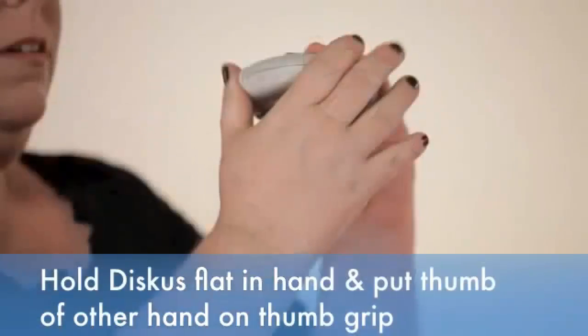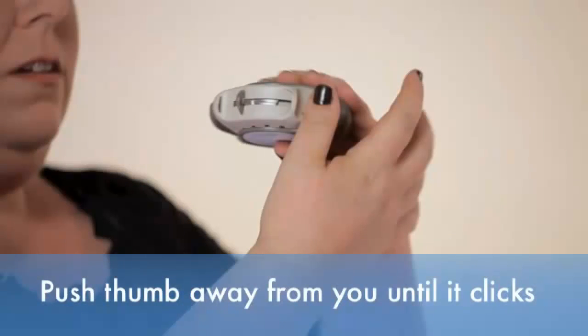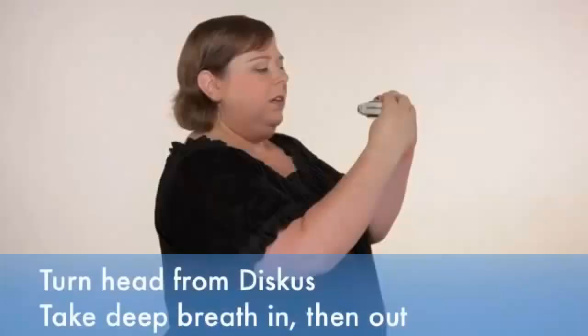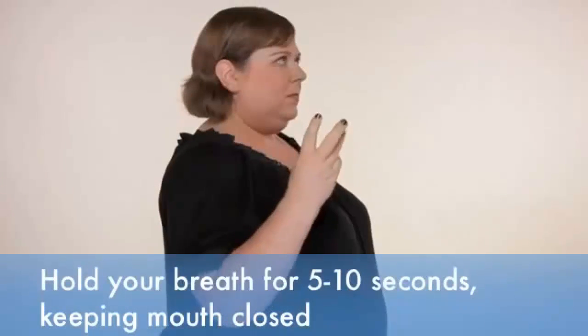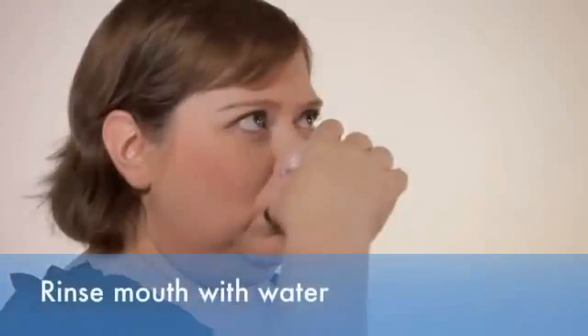Hold the discus flat in one hand and put the thumb of your other hand on the thumb grip. Push your thumb away from you as far as it will go until you hear a click. Hold the discus level like you are about to take a bite of a hamburger. Slide the lever away from you as far as it will go until it clicks. Turn your head away from the discus. Take a deep breath in and breathe out. Seal your lips around the mouthpiece. Breathe in deep and steady through your mouth. Hold your breath for 5 to 10 seconds or for as long as you comfortably can with your mouth closed. Breathe out slowly through your mouth. Rinse your mouth with water and spit it out.